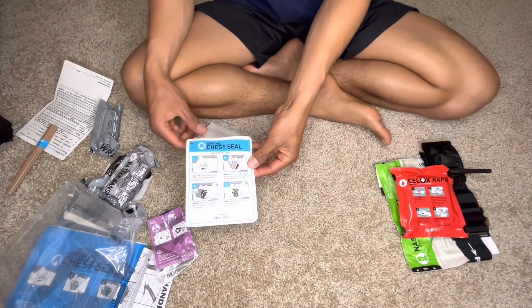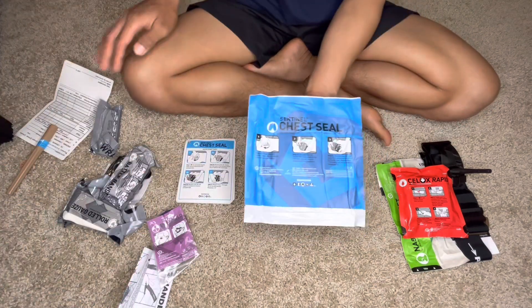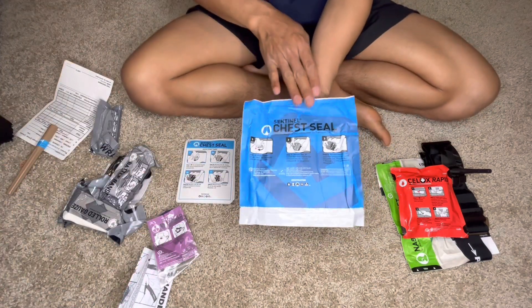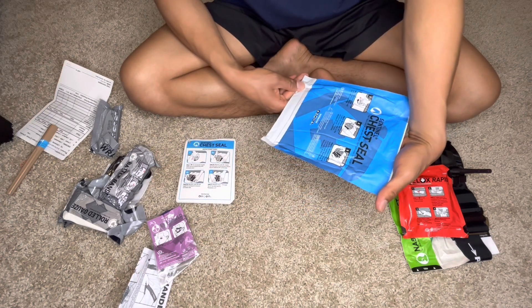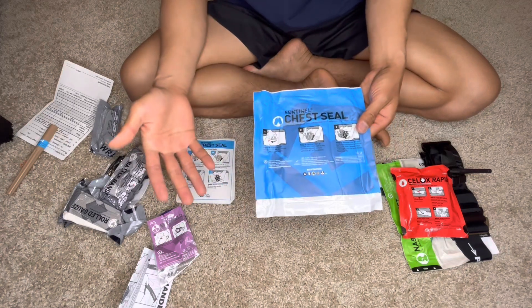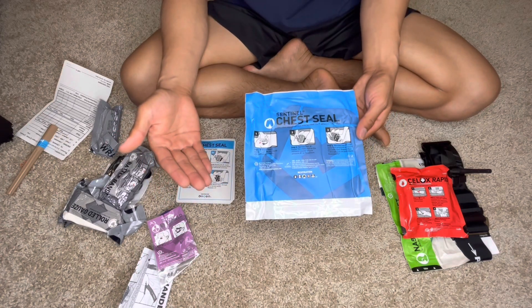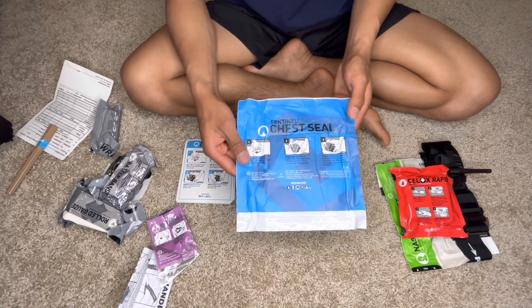The next one will be the chest seal. This is the chest seal — it's actually pretty new to me because this is not the brand that we used before. I'll show you a comparison of the chest seal we used before on a different video.